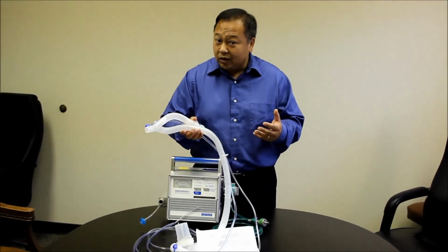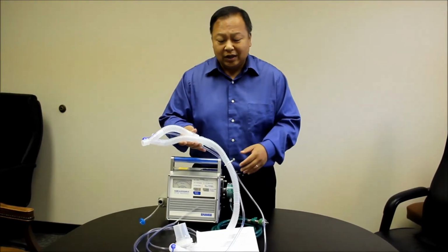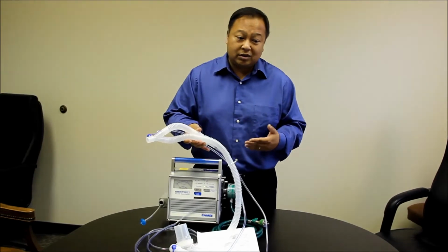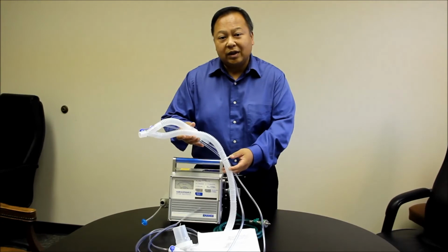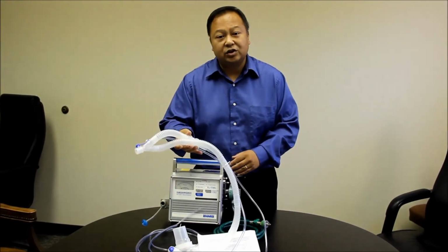If a patient's awake, alert, they're not going to like breathing through this. It's kind of like breathing through a straw. And so when we're putting a patient on pressure support, positive pressure support, it'll allow them to breathe a little bit better while they're on this ventilator tubing.